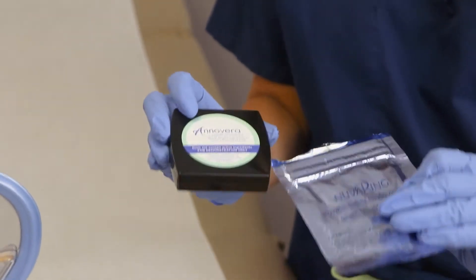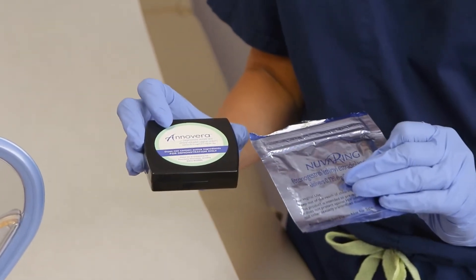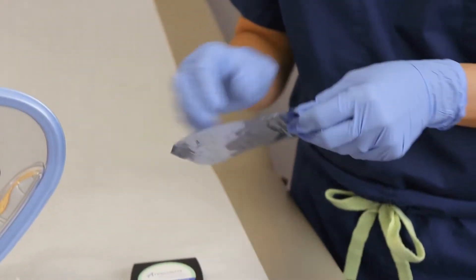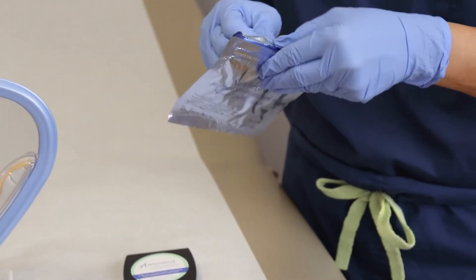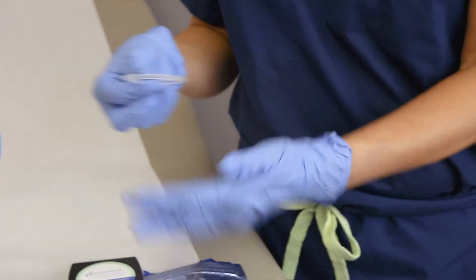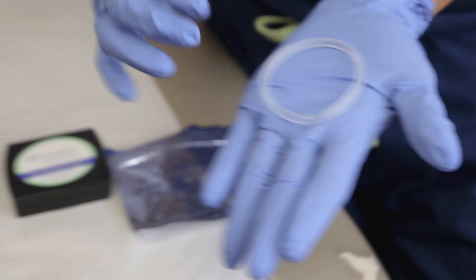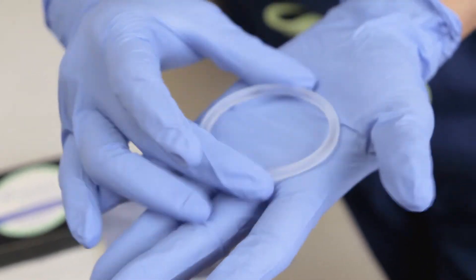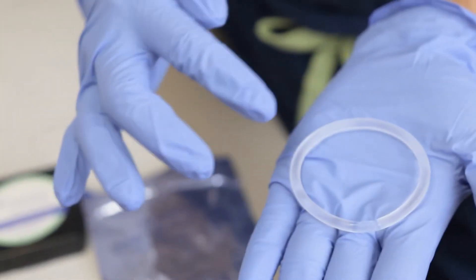Now let me take this NuvaRing out of the package and show it to you. Look at it — it's a very small, soft, flexible ring, and the ring has got hormones in it.